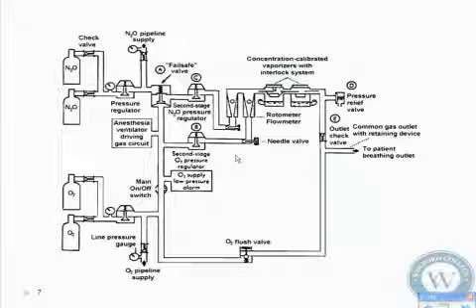There's one other safety feature here called a pressure relief valve. If you accidentally give too much pressure to a patient, or you close the expiratory side with your APL valve, which is an automatic or adjustable pressure limiting valve that we can control, the patient cannot exhale anymore, the balloon blows up really big, and pressure in the lungs is huge. This valve can kick in at that point. Once it reaches a certain pressure, the valve will open up and allow the patient to exhale through the inspiratory side. So that's another safety feature.